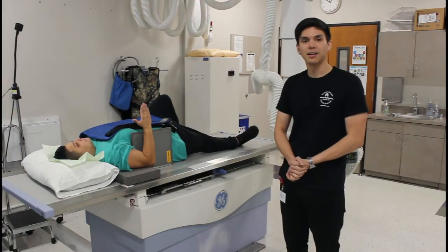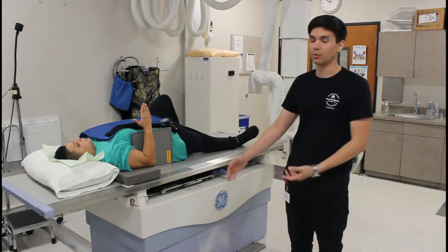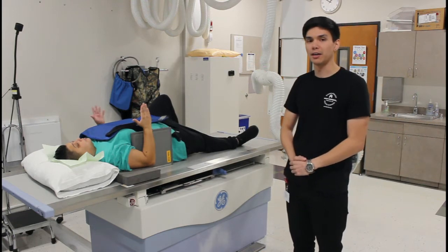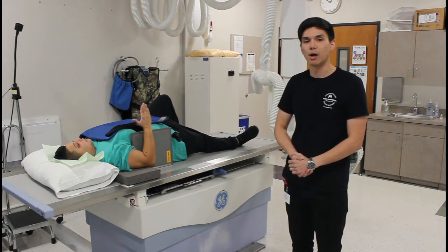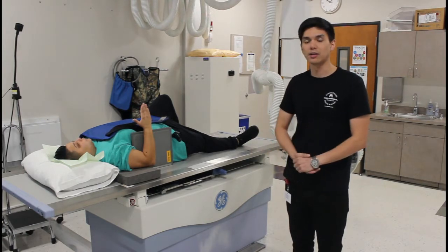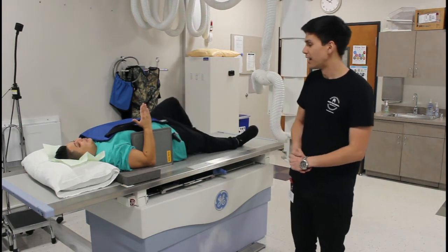And we're back. We are continuing with the Coyle method, but instead of doing a seated position, we're going to be doing it supine with Mel here. So we do a supine Coyle method for the radial head when the patient has been in a previous trauma situation. So they typically will have lower leg concern for fracture or further fractures surrounding the body.